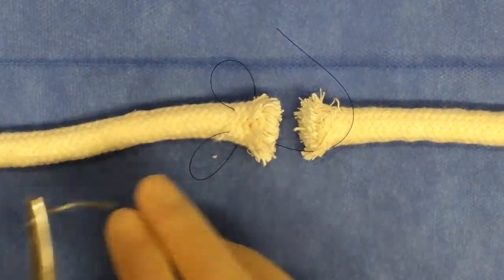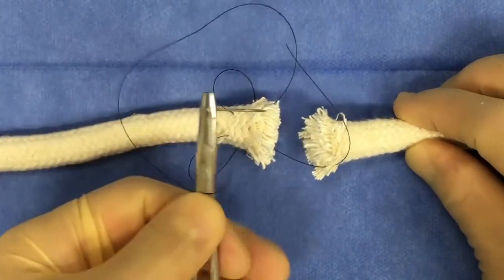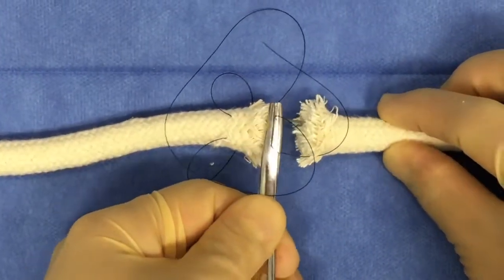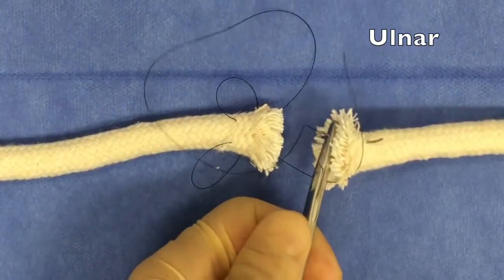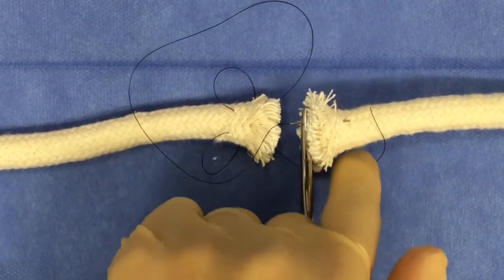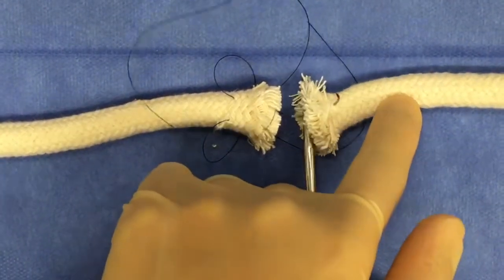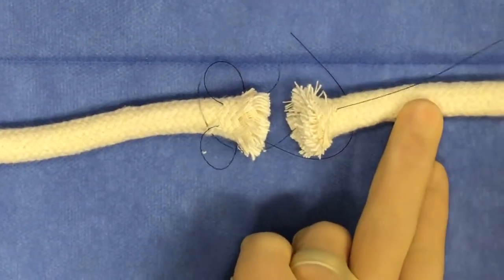Your next throws will focus on the other end of the lacerated tendon. Again, you're going to go intratendinous through the lacerated end of the tendon. Assuming that we just came through on the ulnar side, we'll stick with the ulnar side as we come out on the dorsal aspect of the other side of the tendon. And again, vice versa. This is to maintain that horizontal mattress suture pattern for this technique.